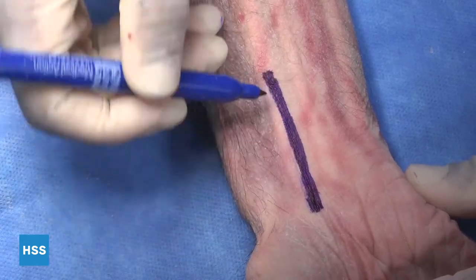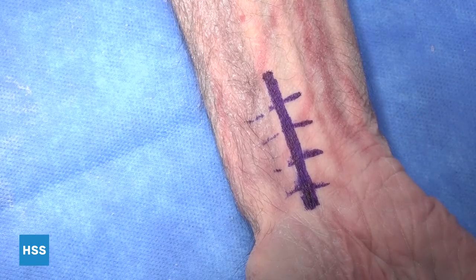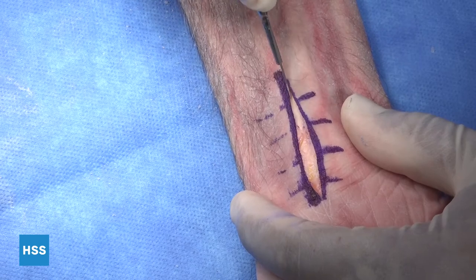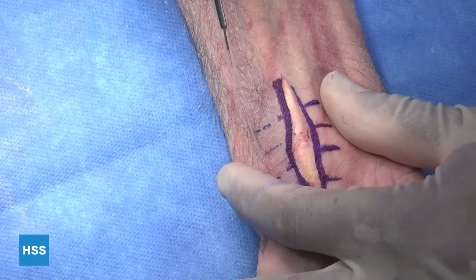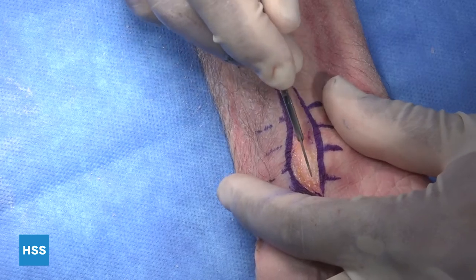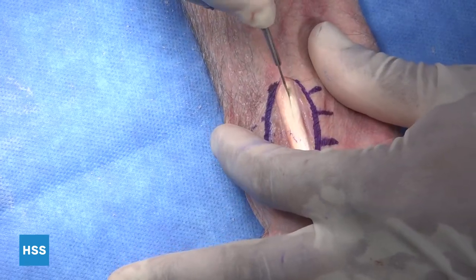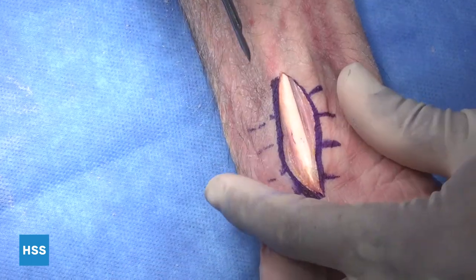We have our incision right here, and we'll mark off before we plan to repair. Then we start with a 15 blade directly through skin and through dermis. After making our incision, we'll be able to see the volar aspect of the FCR tendon sheath.